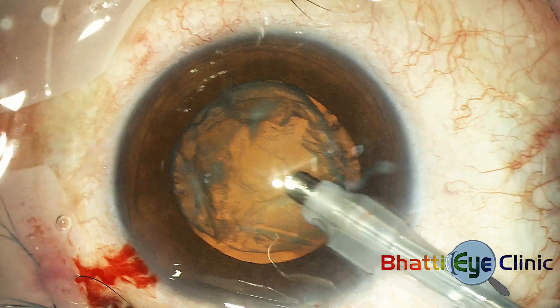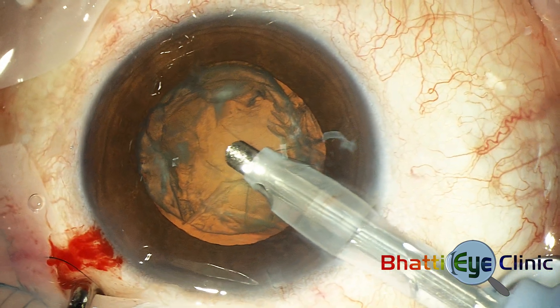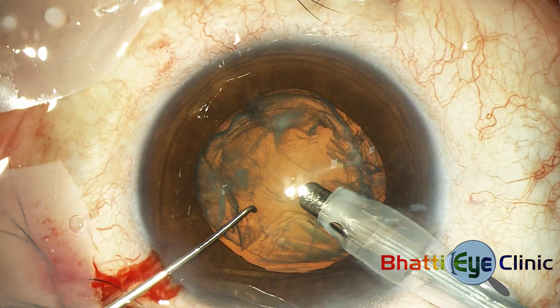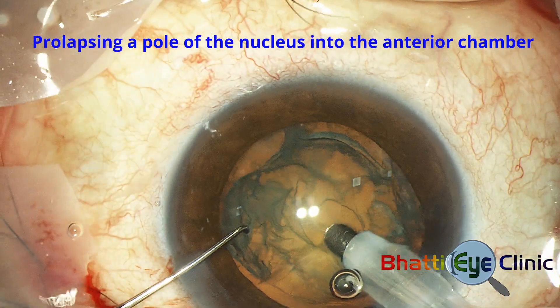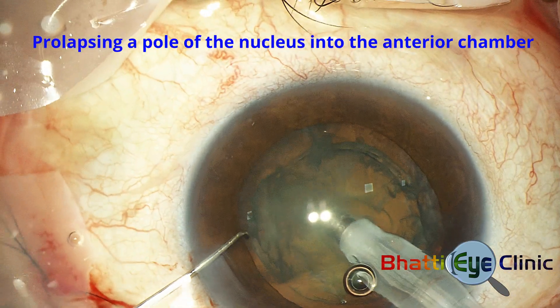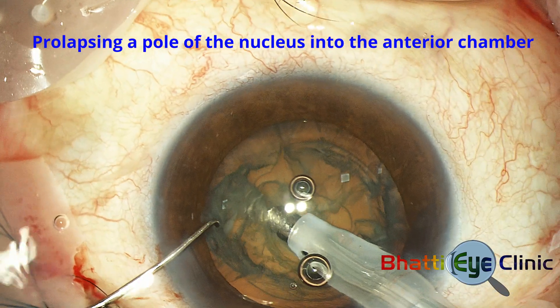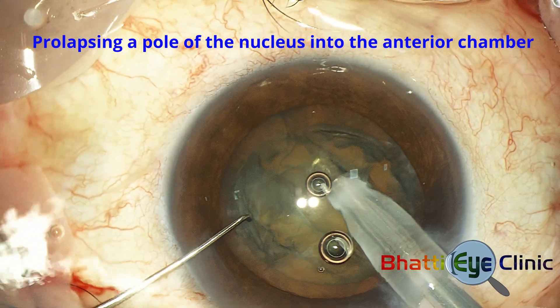There are many techniques for breaking up the nucleus for phacoemulsification. Here the left pole of the nucleus is maneuvered by suction into the anterior chamber, a dialer inserted under it, and a somewhat manual method used to chop the nucleus while low phaco power is applied. The dialer claws away at the nucleus and bits are broken off to be emulsified with relatively low power.